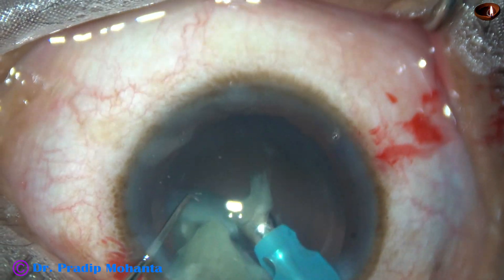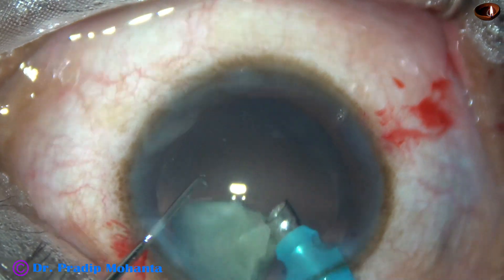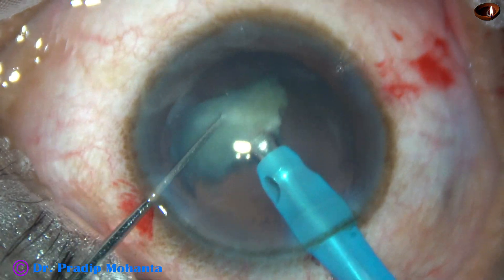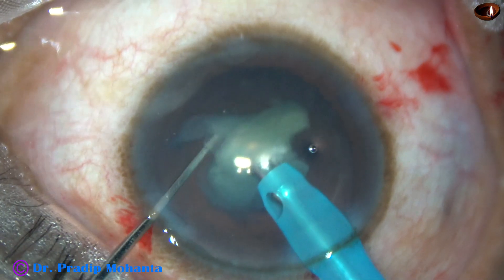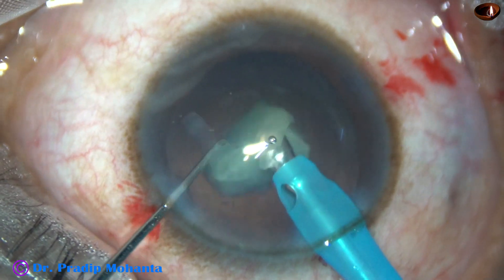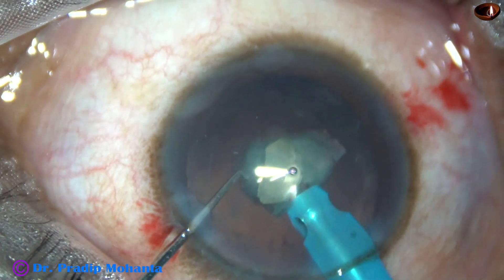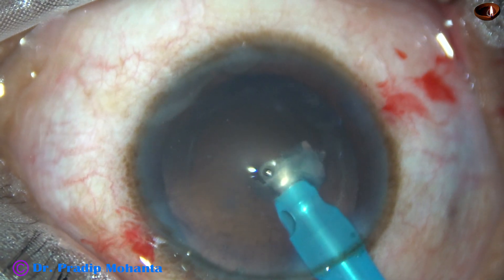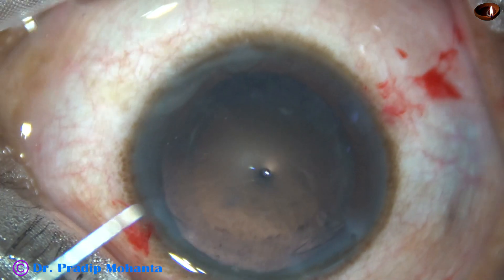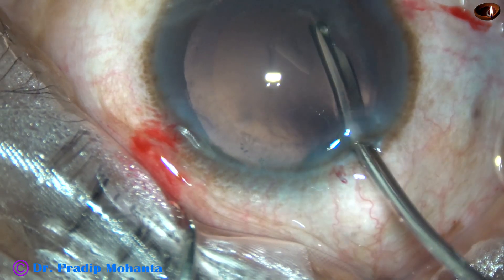This nucleus is not hard, but even in hard nuclei, if we manage the nucleus nicely, the cornea remains crystal clear the next day. Nowadays most of the machines are good — you have very good anterior chamber stability, and the incidence of posterior capsule rent has come down to a great extent.